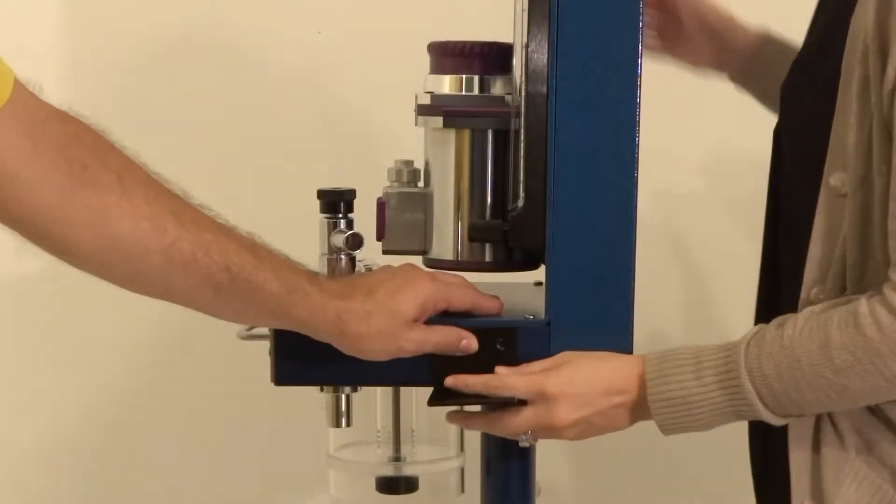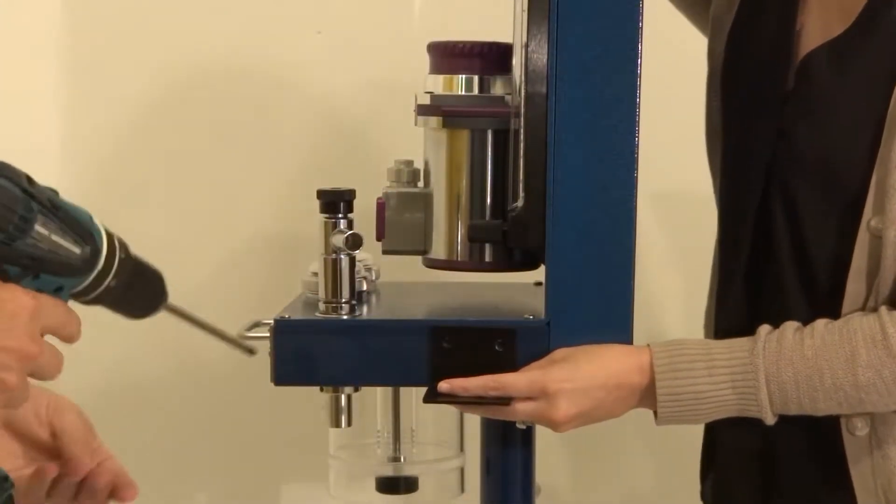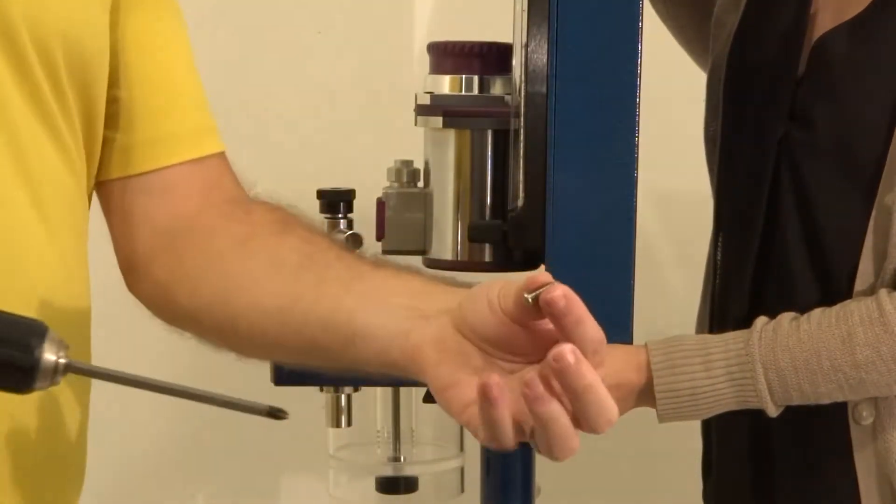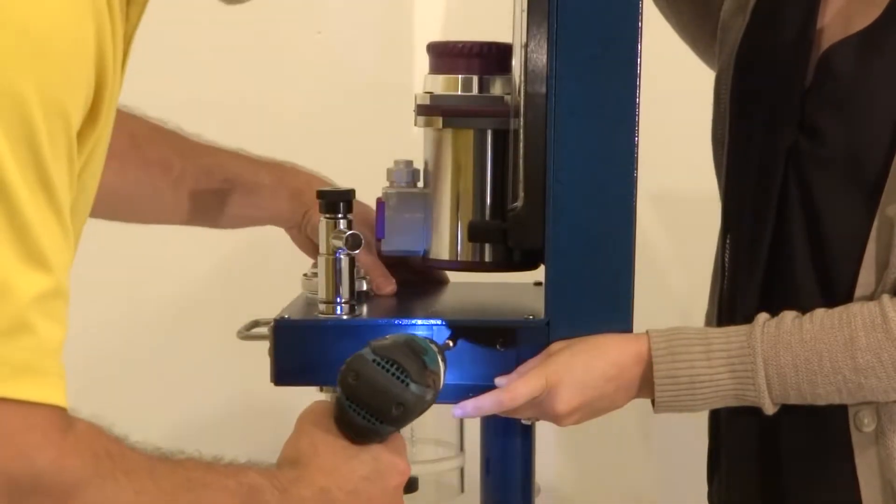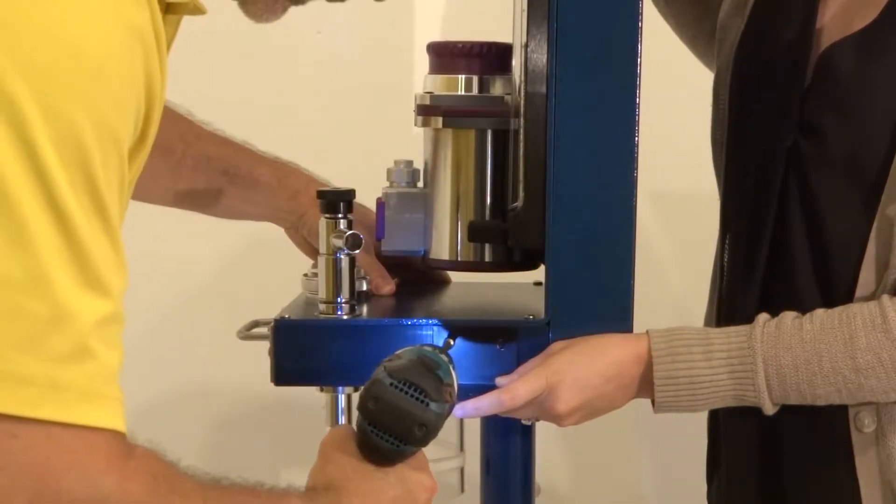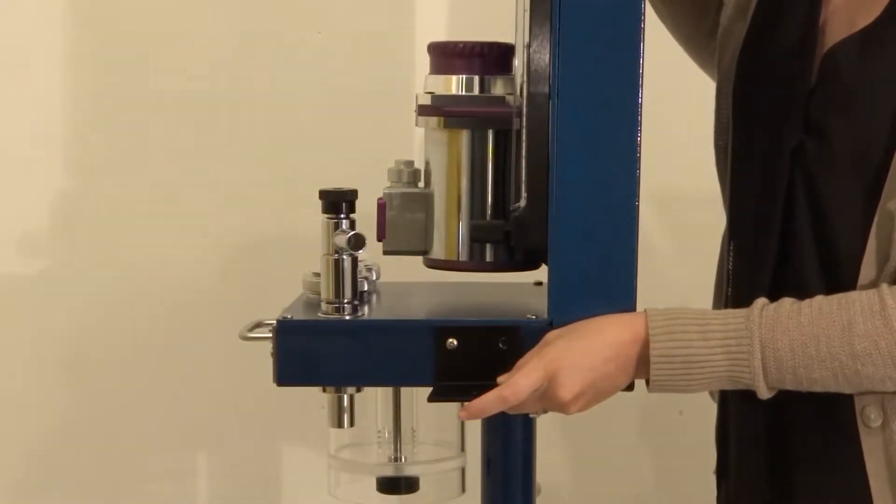If you require assistance, have a second person hold the bracket in place. Use a battery powered drill to drill the two supplied screws through the holes in the bracket, securing it to the machine panel.